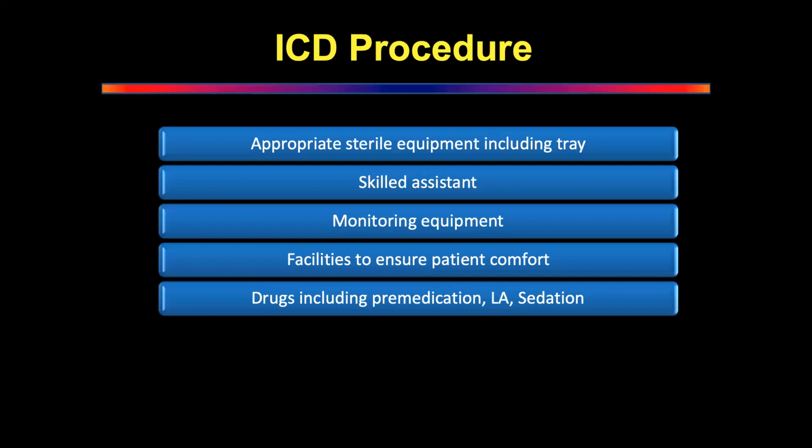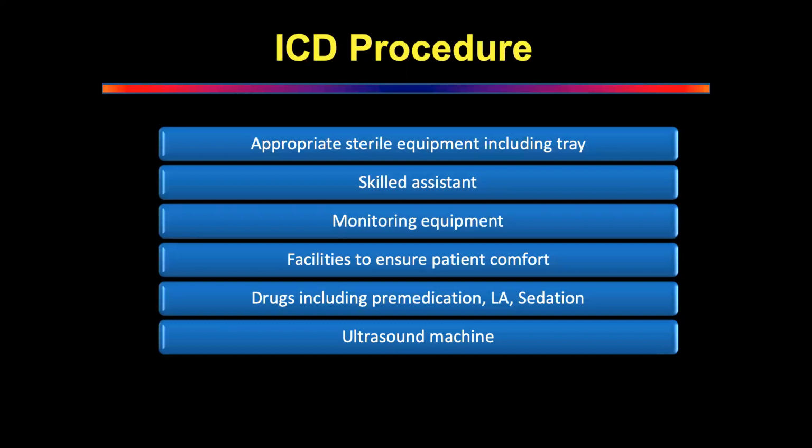The side is marked. Well done. What else? It should be confirmed with a chest X-ray, and done under ultrasound guidance then and there. Thank you. God bless you. Whoever said ultrasound, well done. Recommendations: make sure that ultrasound is available. You have to make sure. This is part of the guidelines. You should not put in chest drains without ultrasound guidance. Nowadays, it is in the NICE guidelines. So if you're going for FRCS exams, I know you do this.